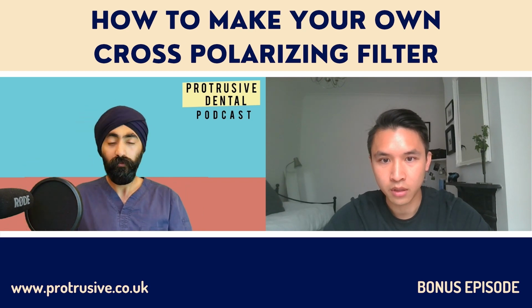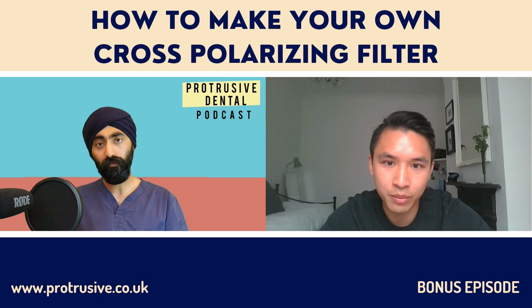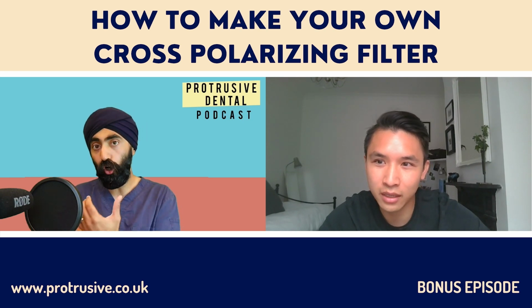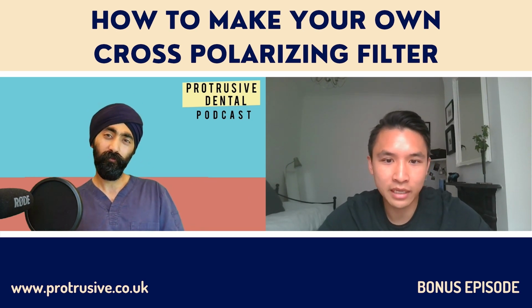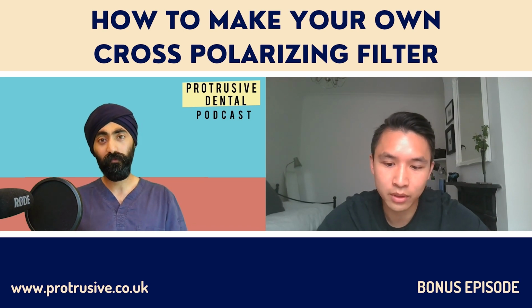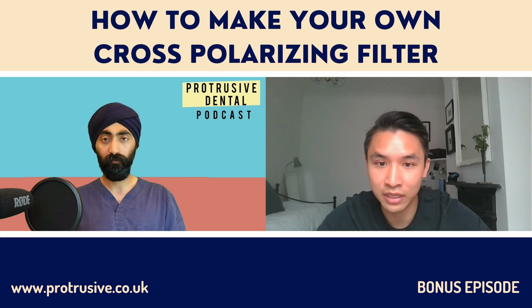Yeah, so I've not used it a huge amount, to be honest. I've used it on a couple of cases just with composite buttons. That's pretty limited for me. Well, talk about how you think it helps you in that phase. Well, supposedly it gets rid of the specular highlights, which lets you analyze the shade better, and that's certainly something I've found helpful when putting the buttons on the teeth. I find that it really does help.